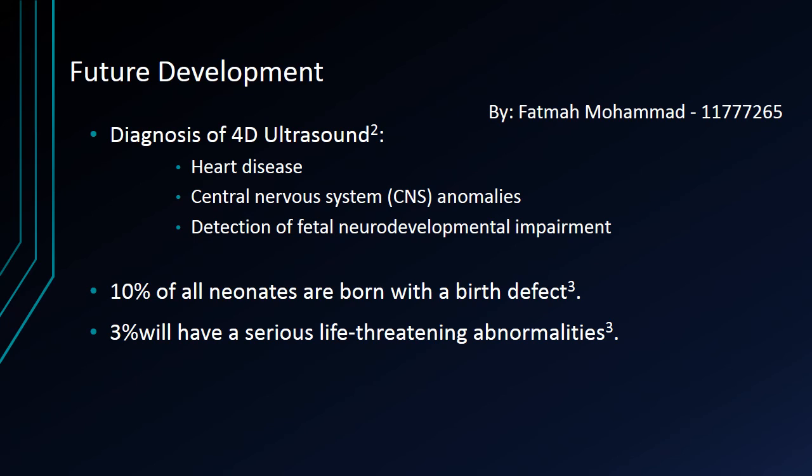Approximately 10% of all neonates are born with birth defects, and moreover, 3% will have serious, potentially life-threatening abnormalities. Therefore, 4D ultrasound scanning should be developed and used more in medical diagnosis in order to raise awareness and reduce these serious numbers.